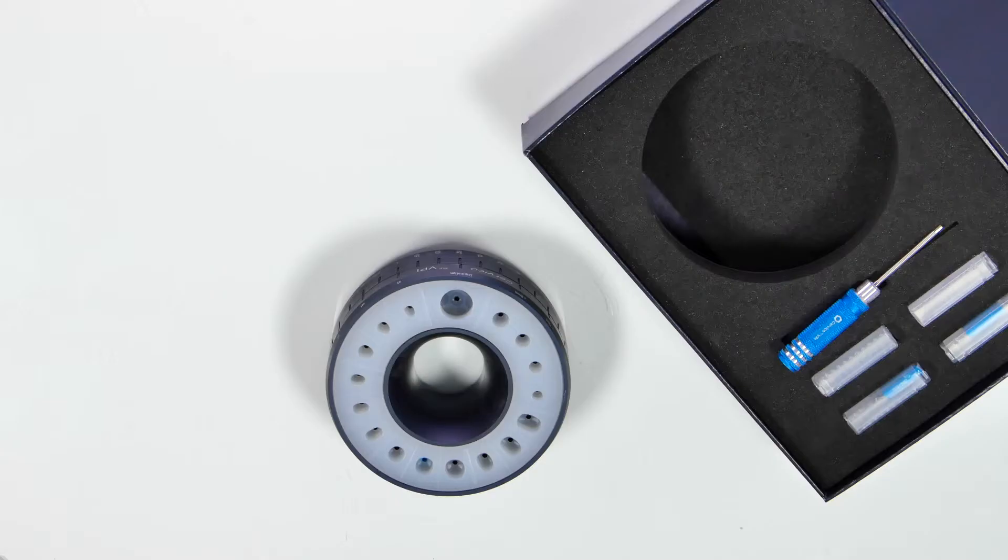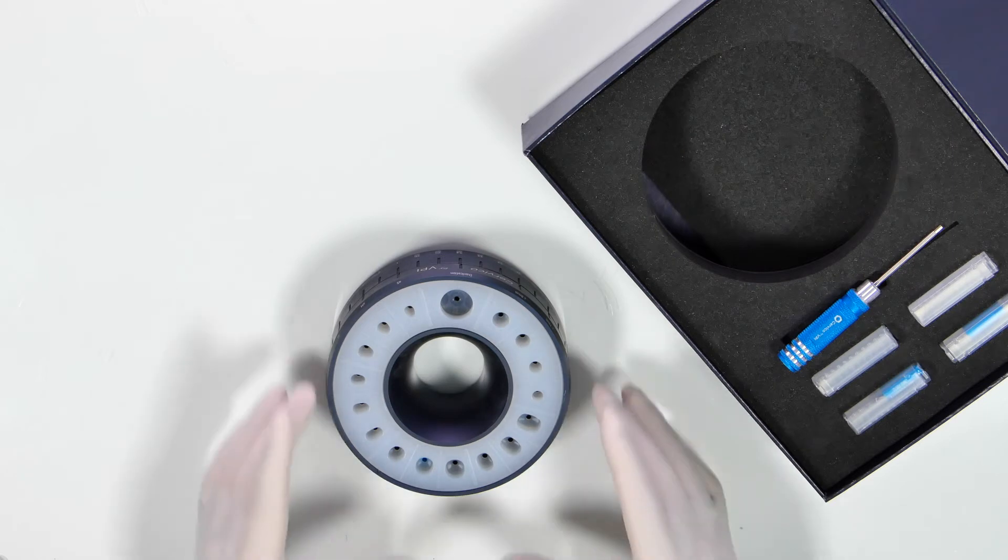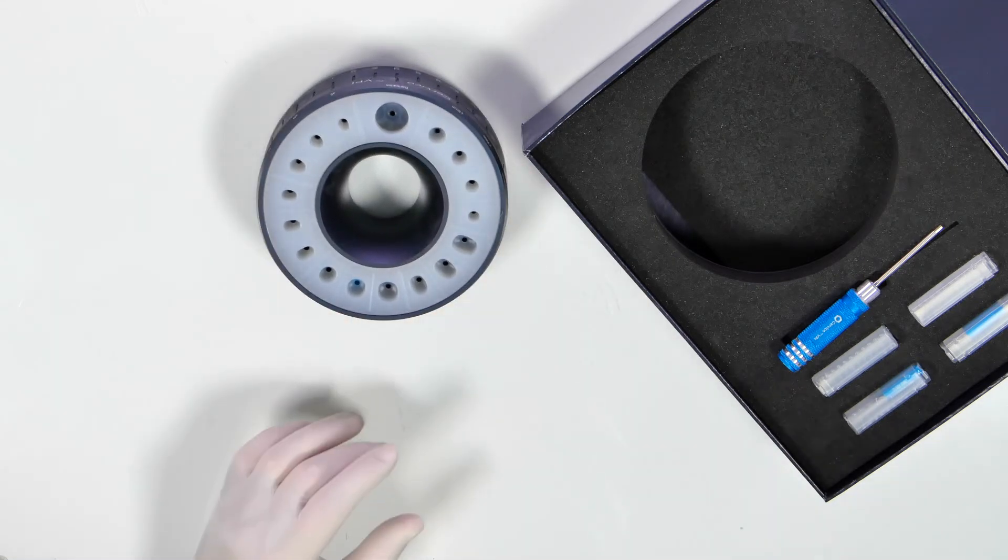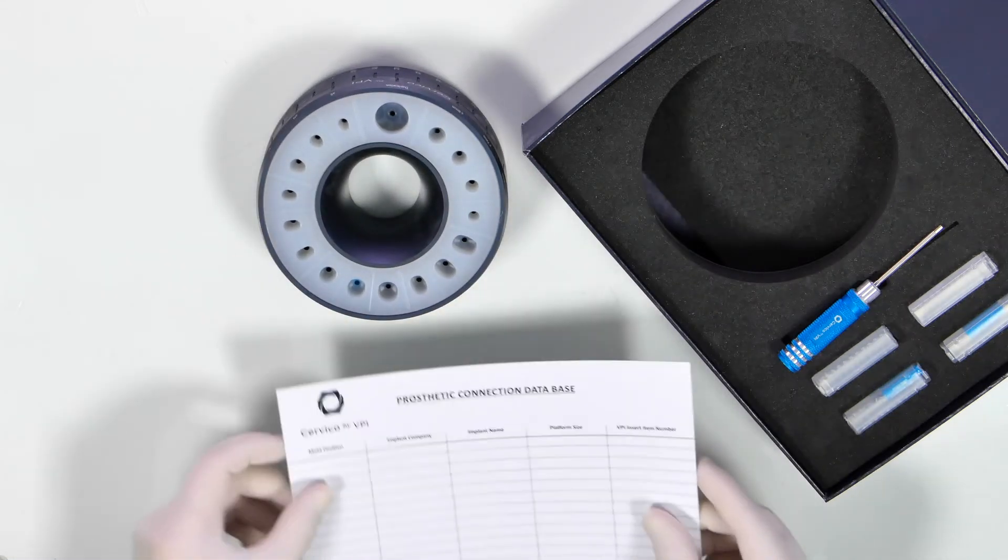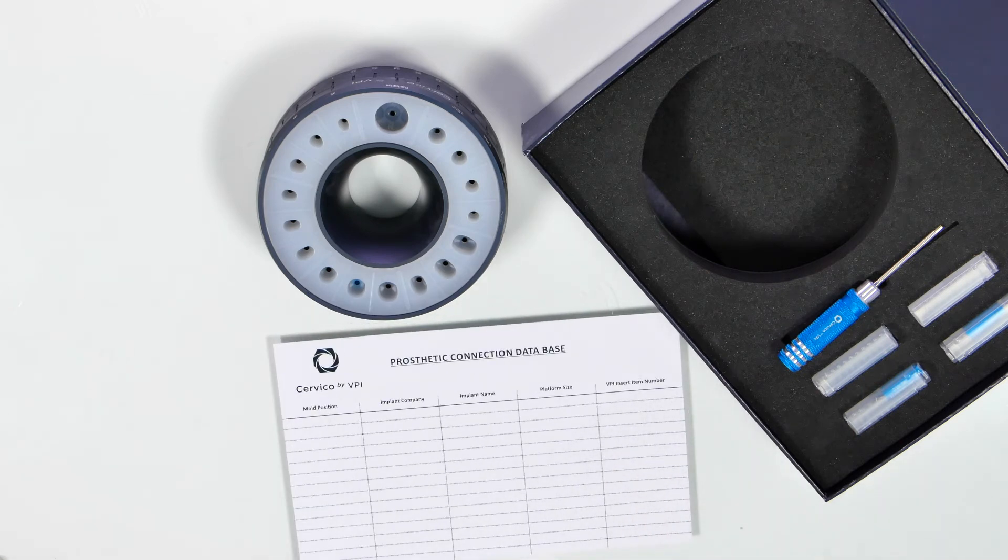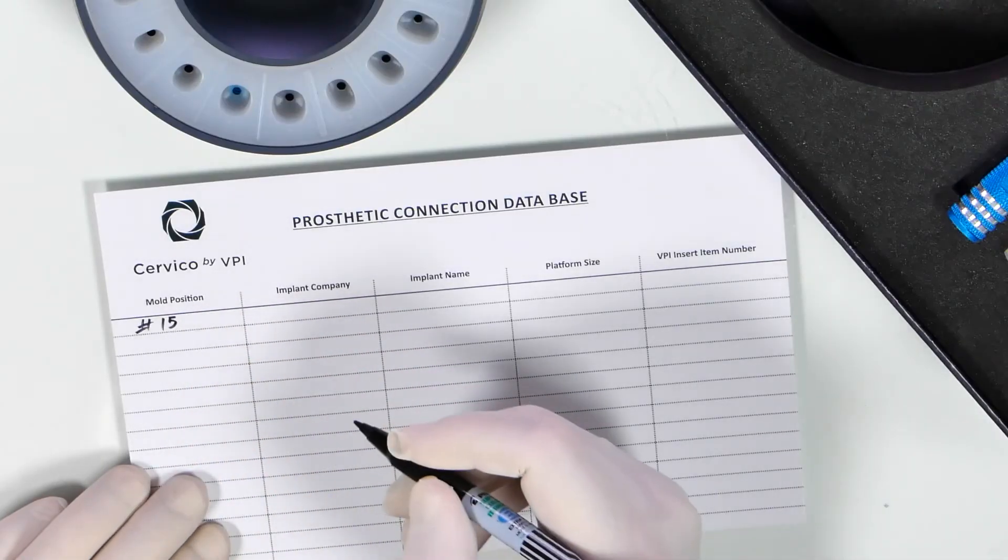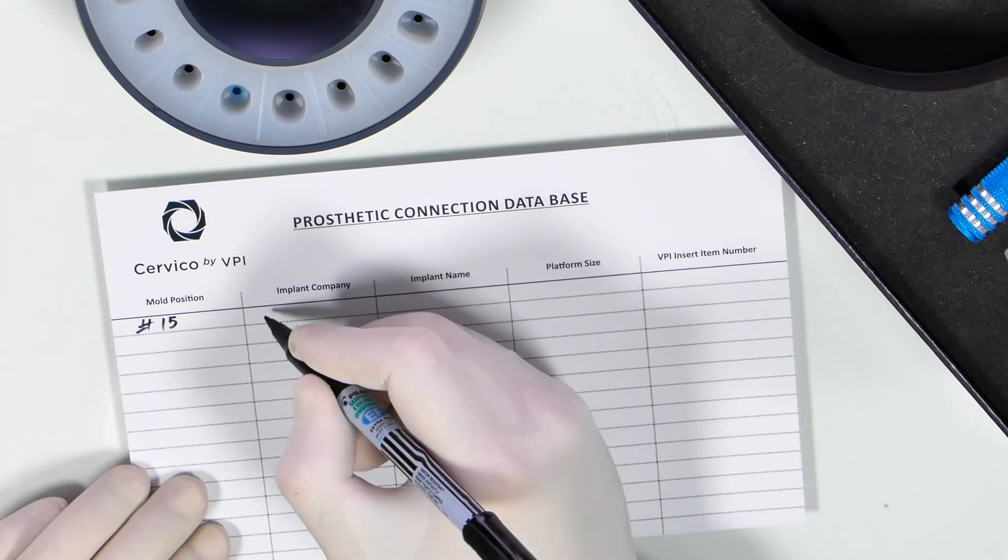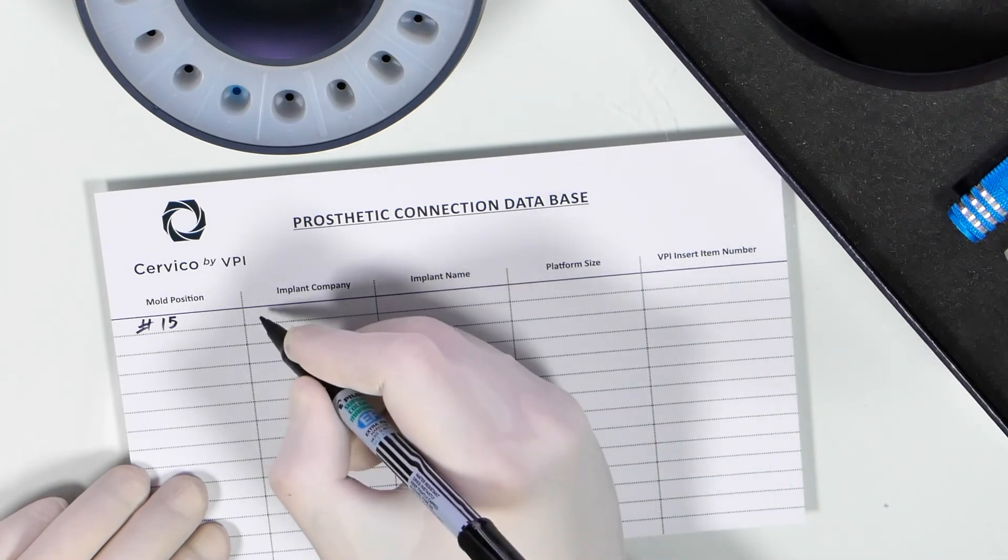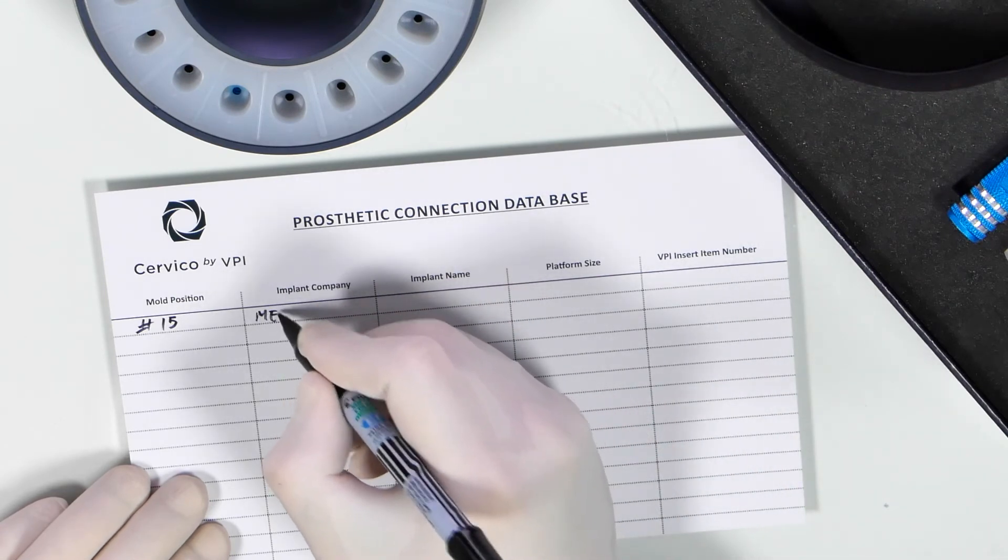The VPI prosthetic connection inserts are an integral part of the base of the mold. Once you place your order, you will have to specify what kind of surgical protocol you use. Once the company installs the insert into the base, it will fill in the prosthetic connection database card for you so that you are aware of the position that the insert has been installed.